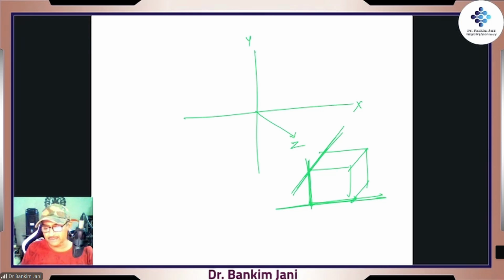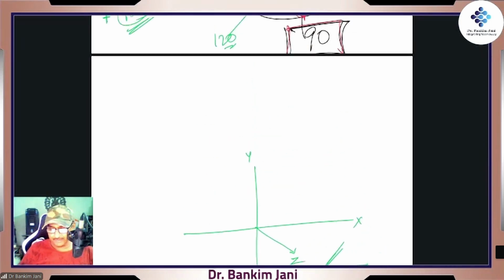In all these things, if I write it like this, the lateral part, lateral means from the left side. Which leads were showing as if we are watching from the left side? Those were over here. Over here it was AVL, correct? It was watching from the left side.